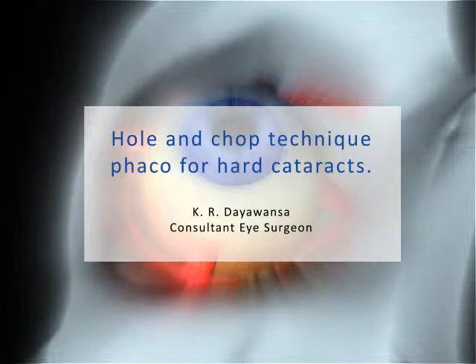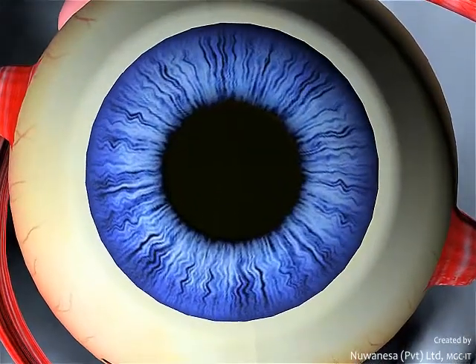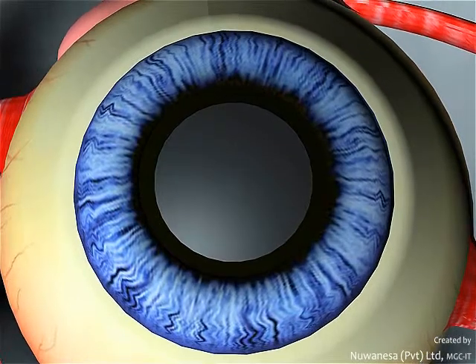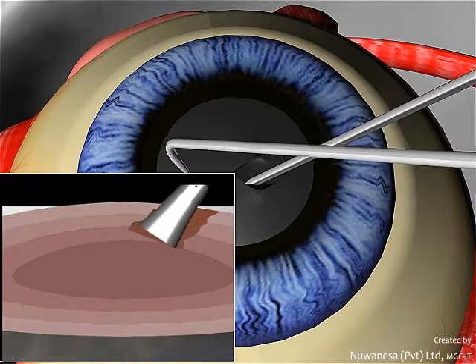This novel technique describes how you could remove hard cataracts without compromising the ocular structures. Once the capsulorhexis is made, a central hole is made up to 90% of the depth of the nucleus.